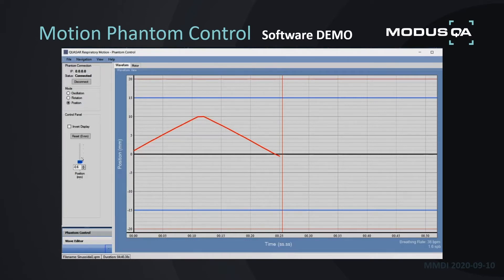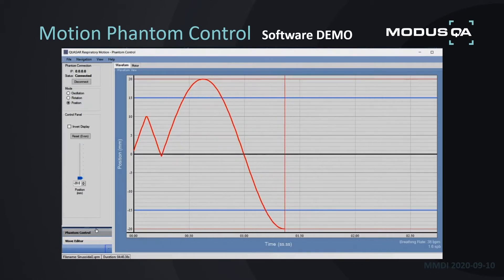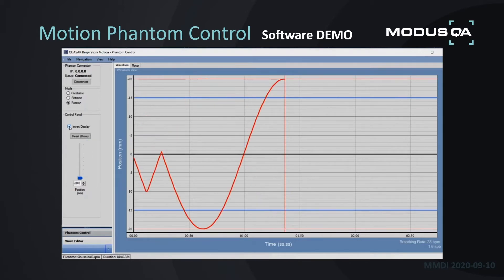That's Position Mode — it has a full range of plus 20 to minus 20 millimeters, very easy to use. It also has the option of inverting your display for any of our waveforms, which is just a preference for how you wish to view it.